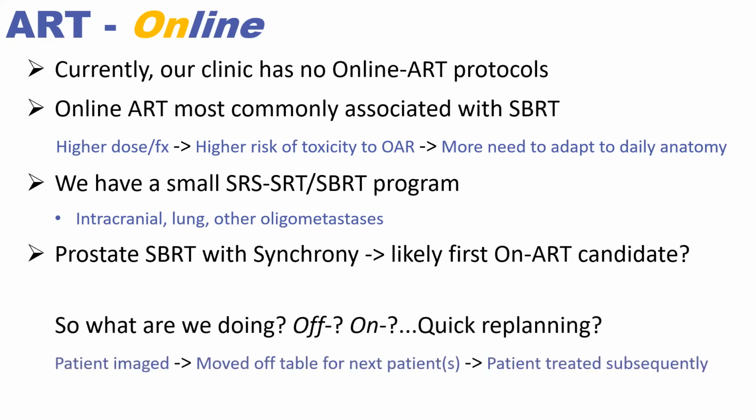So what are we doing offline or replanning? Essentially, what works for us in our clinic is we image the patients. When we see somebody with a large difference, we move them off the table. We get our doctors down to review our CTVs, and then we do the process. Then we treat them a couple of patients later. So it's in between, but it works for us.